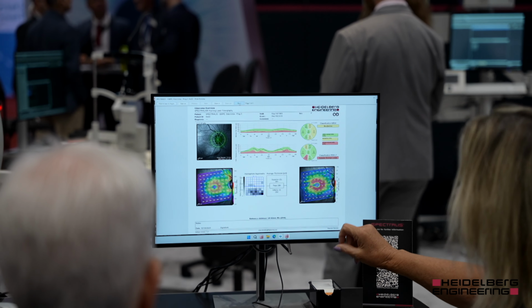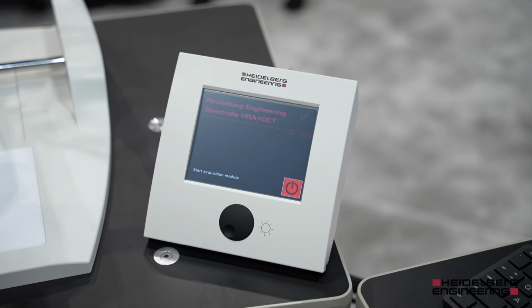And so, glaucoma progression with OCT is kind of like detective work. You're trying to use one set of scans to say, I think there might be something going on, and then use other images to help prove that hypothesis. I guess you can think of it that way. So the fact that there are nice complementary scans that have very consistent data from time to time for a patient really gives me the confidence in believing the output.